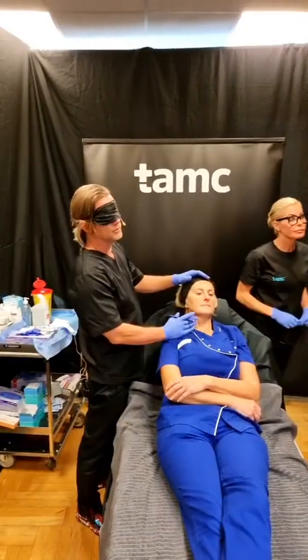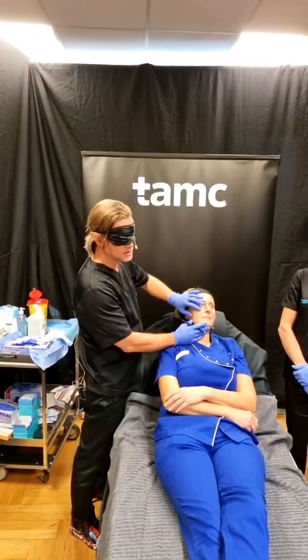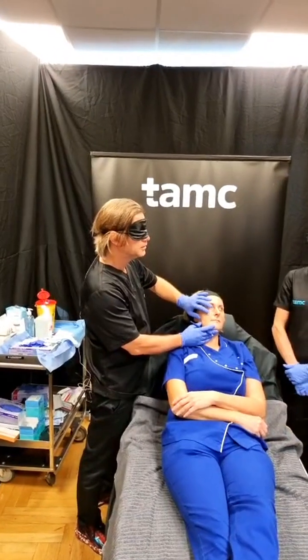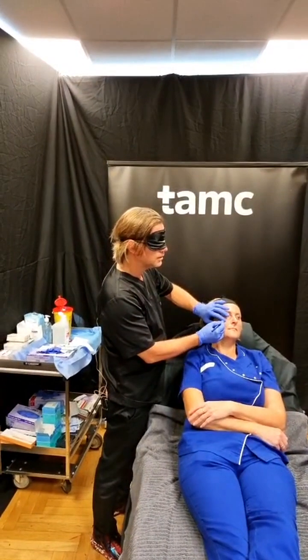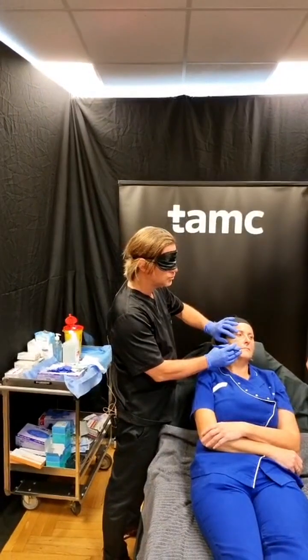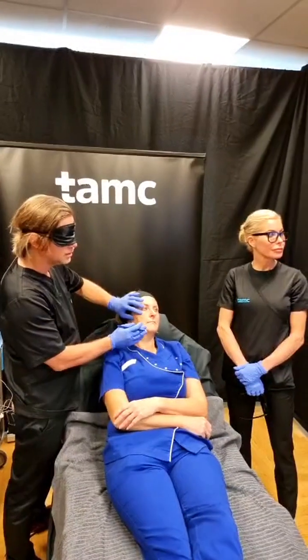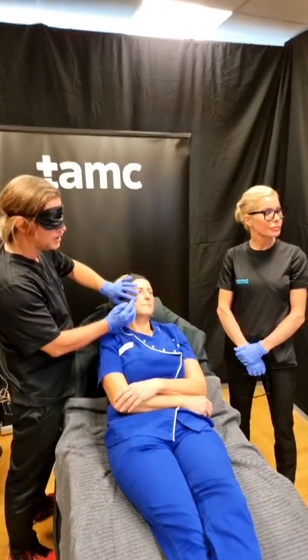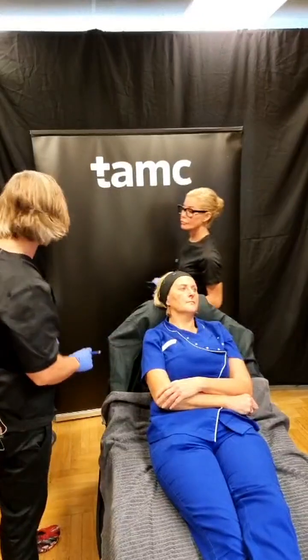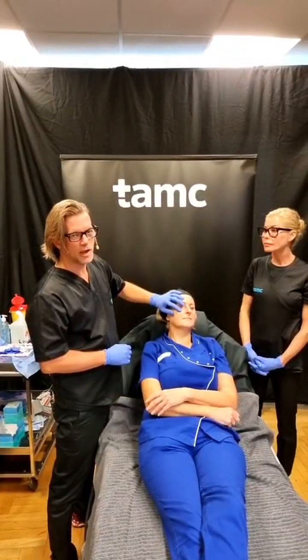It's vital to not just watch your patient, but actually feel where the volume loss is. This is so much more accurate than watching. Normally I would look out the window. We don't have a window here, so I'm blindfolded. With volume here, I feel the orbital rim not being cushioned by any fat tissue here. I suspect somewhere on the zygoma here there's volume loss. So try this on your own eye, and you will find that feeling is so much more accurate than looking at the shades.